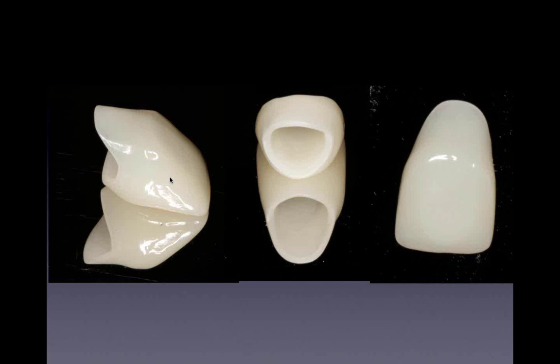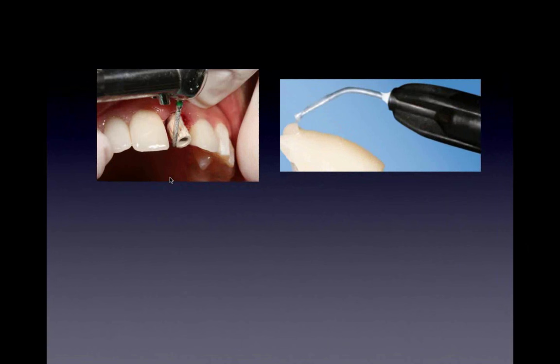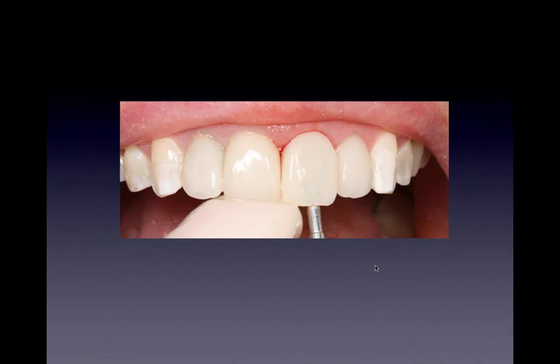It costs like $45. It's very inexpensive. It's basically an ion crown, but the exact shape of the patient's tooth. So think about having the exact shape of the patient's tooth as an ion crown, a prefab crown. We're using our flowable composite to create that gingival architecture. We're polishing it. We're in the mouth now. You see we hollowed it out. And we're going to flow in our composite in there and lock it into position with light cure material.